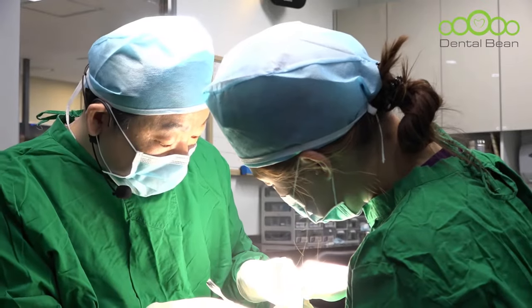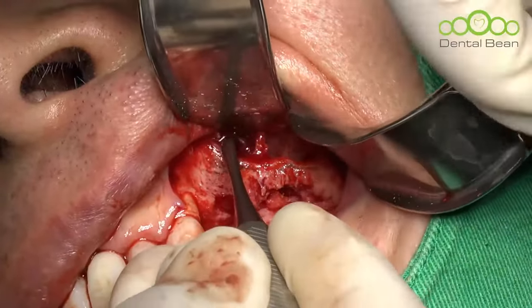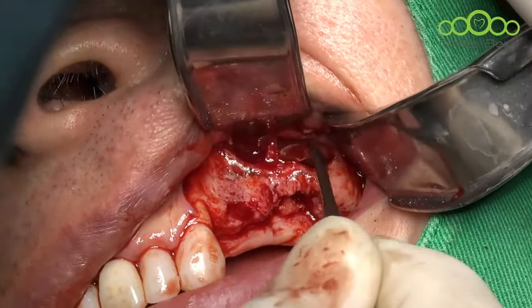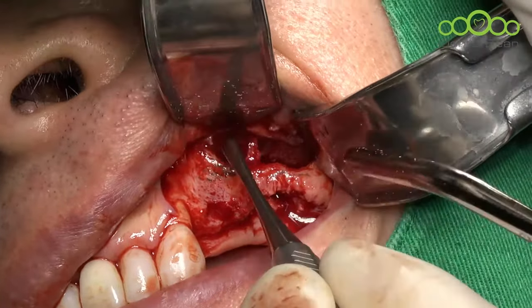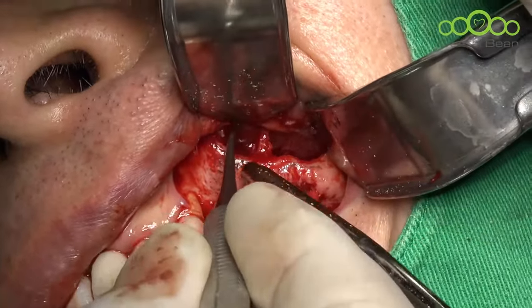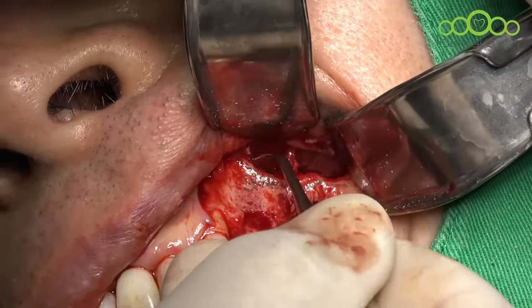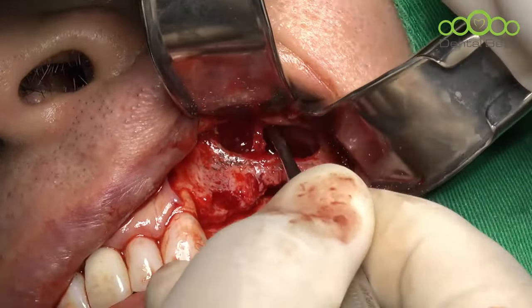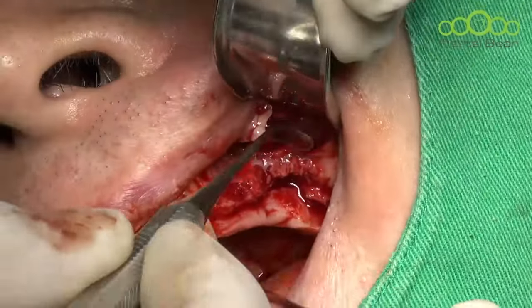Then let's separate the septum side. Be careful when you separate the septum side. Okay, well done. How about anterior? Not bad. The premolar side looks very narrow to reach. So the sinus is also narrow. Enough. And let's separate posterior slightly.